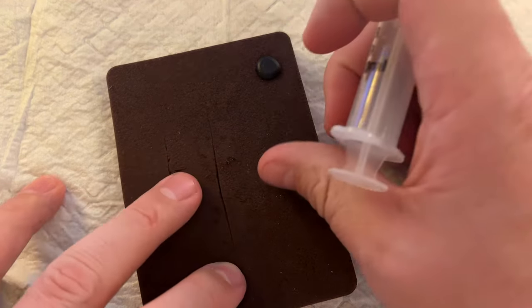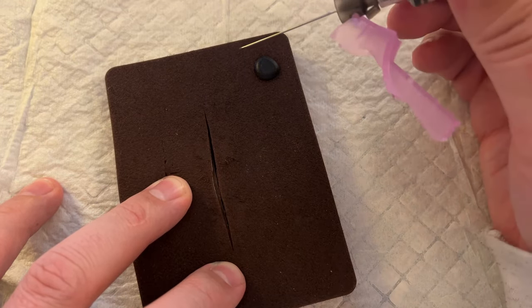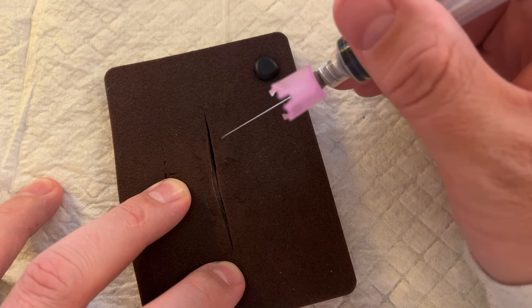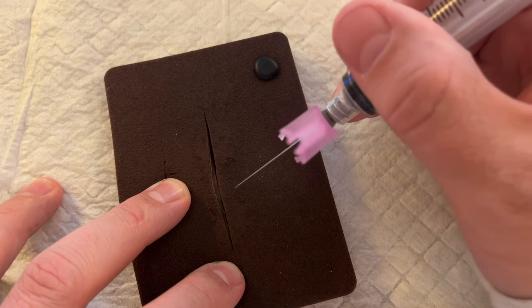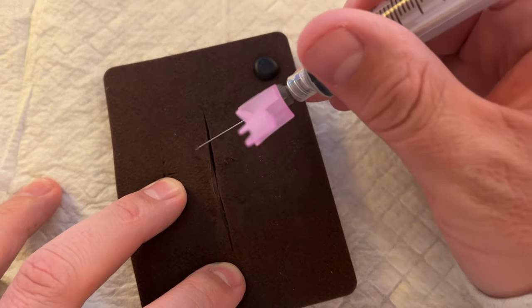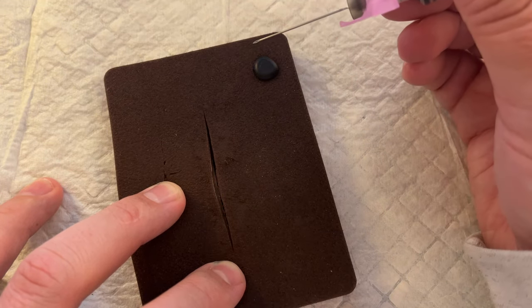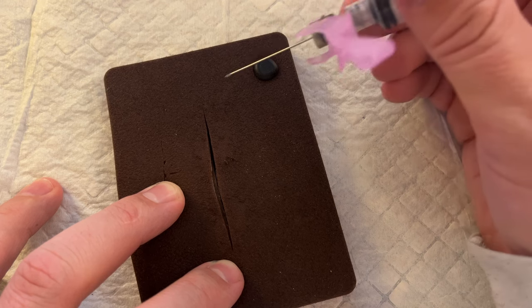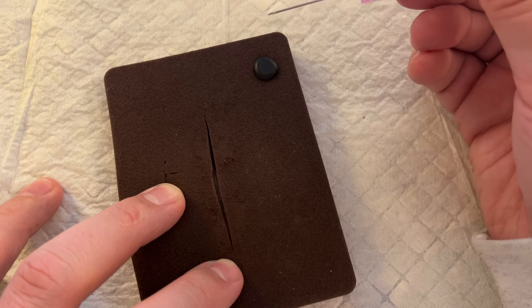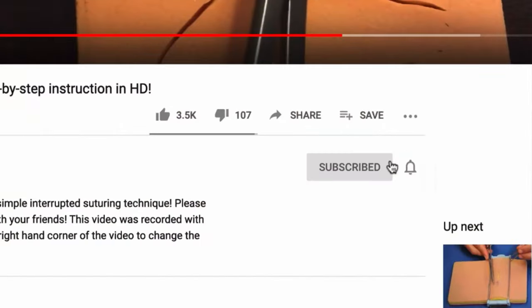We want to do the same thing on both sides so that both sides of the laceration have been anesthetized. Wait about one to two minutes, or a few minutes, then gently check with the tip of the needle and ask your patient if they can feel it — if it feels sharp. As long as they don't feel any sharp sensation along the laceration, you can go ahead and get to work with suturing or stapling. If there's any part the patient can still feel, inject more anesthetic into that area.